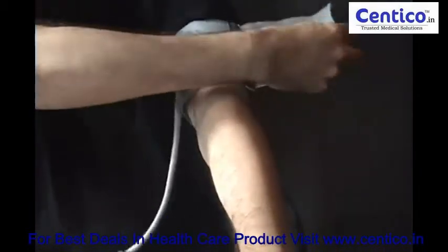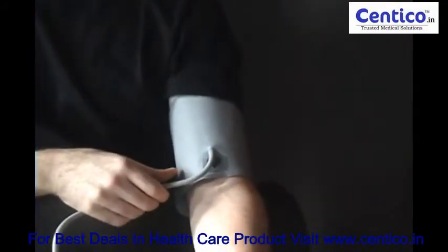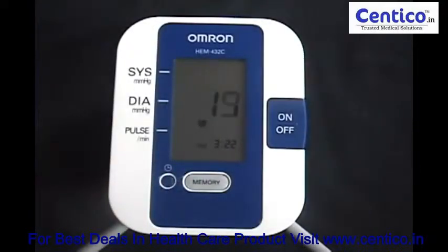Usually you use your left arm to take your blood pressure. Make sure that the cuff is aligned properly, in this case the arrow pointing to your index finger. That way the sensors inside the cuff will be aligned in such a way that they can pick up the blood pressure.